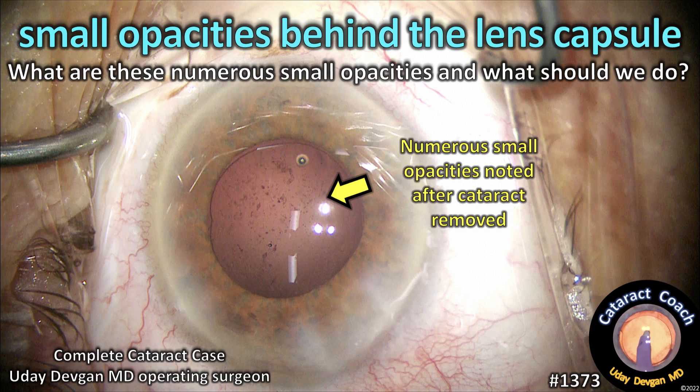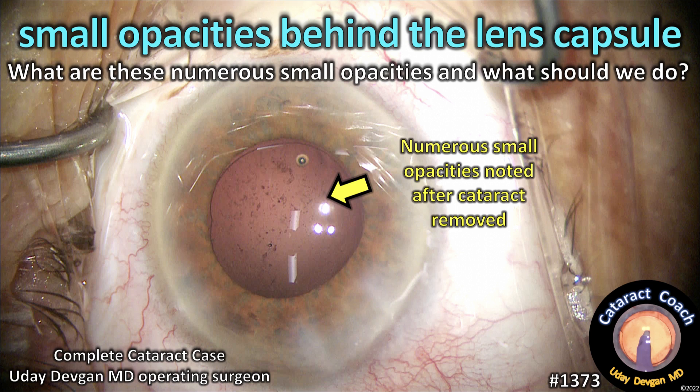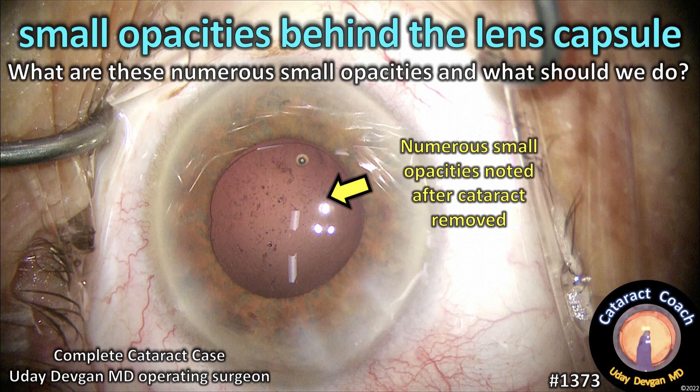CataractCoach.com — small opacities behind the lens capsule. What are all these numerous small opacities, and what do you do about it?